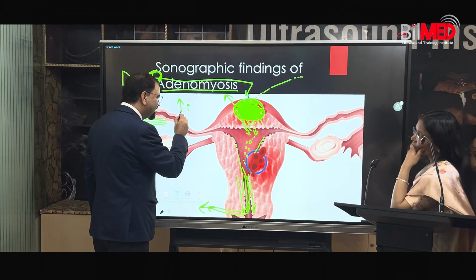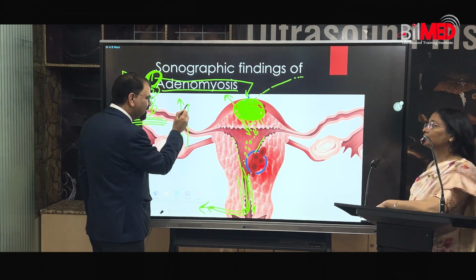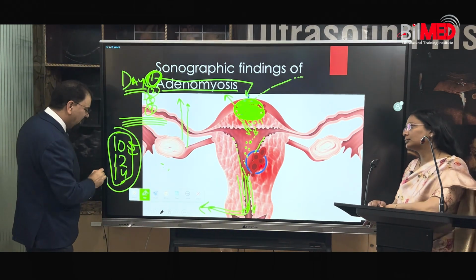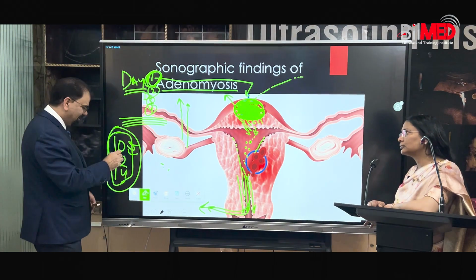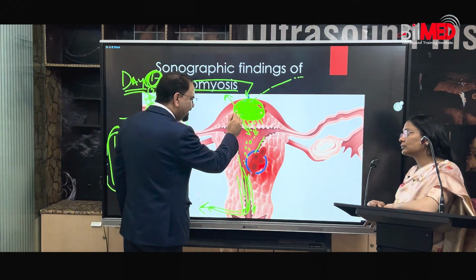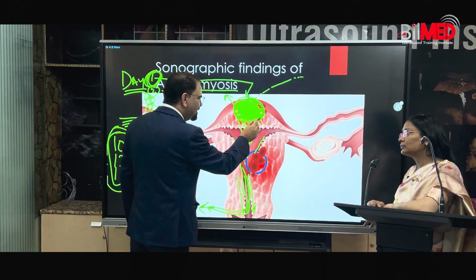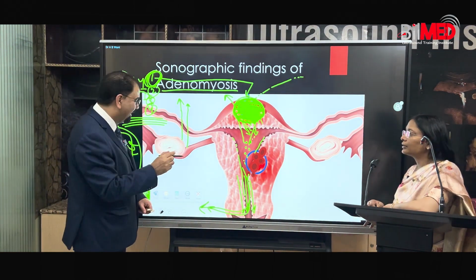Now see, try to understand. Previously it was this much, and now it is this much. Now the blood has got shed out, drained out, I will say, when the pressure is increasing. After releasing the blood from here, what will happen to the echogenicity of this patch over here? Will that decrease or increase? Increase.